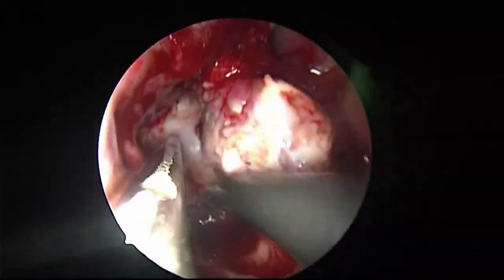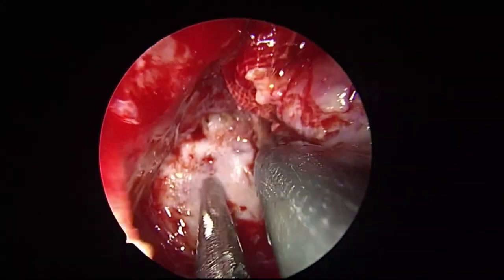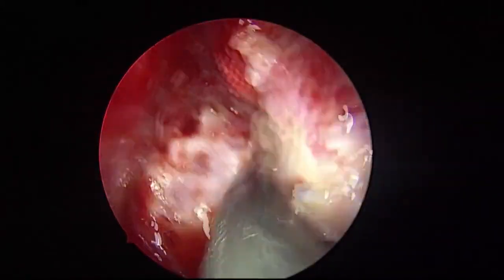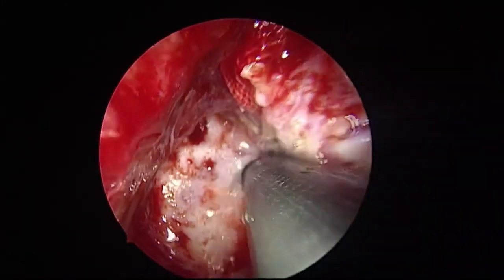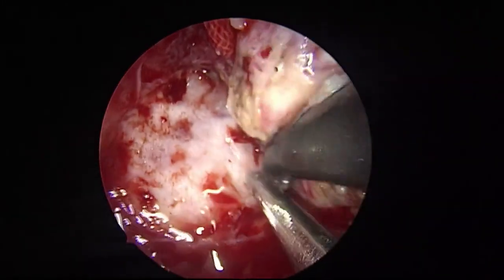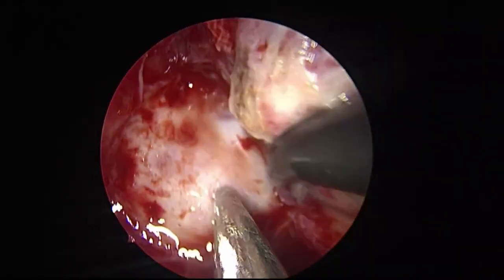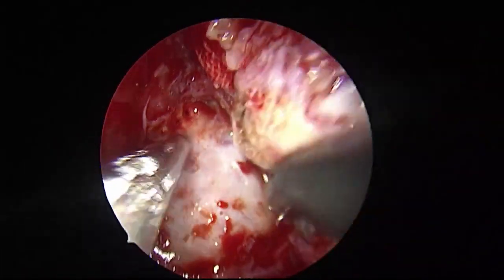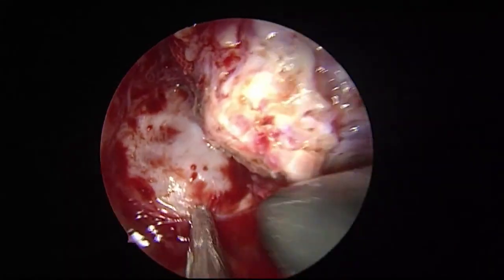See now the medial wall bulge is much reduced. Can you appreciate this? Yes, sir. Earlier it was not allowed even to visualize the posterior wall. Remember, now the posterior wall is clearly seen. So I told you we'll do something.